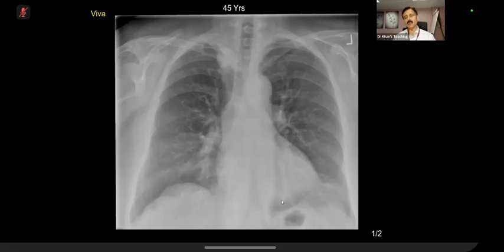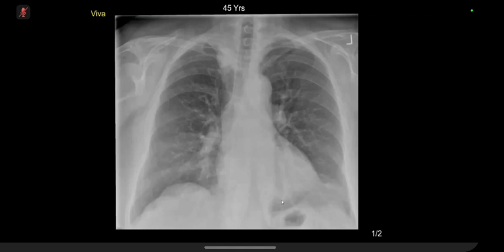Can you go back to the details of the description of this lesion? Hint. What is the cervicothoracic sign? So a cervicothoracic sign is when there's a lesion which is going above the clavicle. And so this could be a lesion which is in the superior mediastinum, could be a thyroid lesion as well.